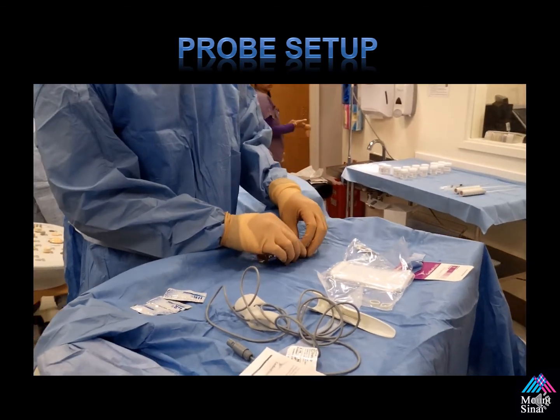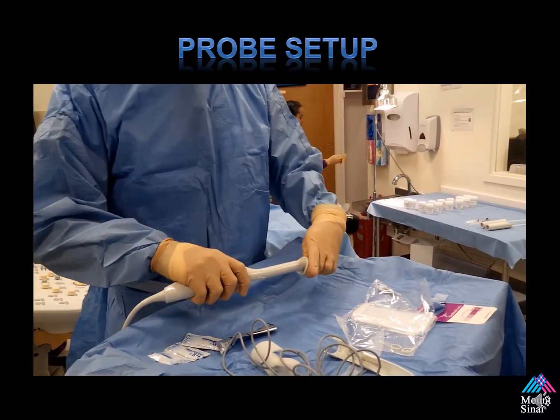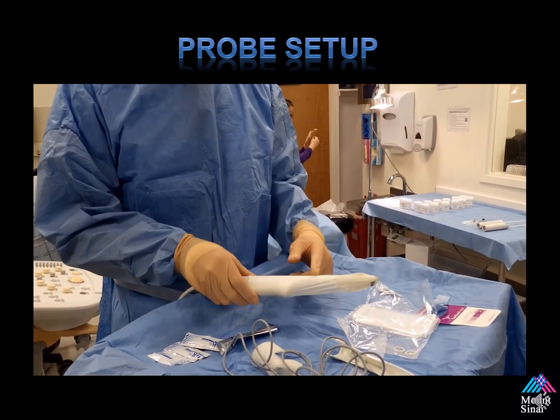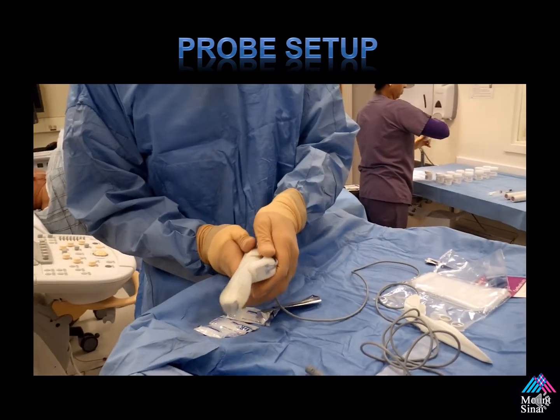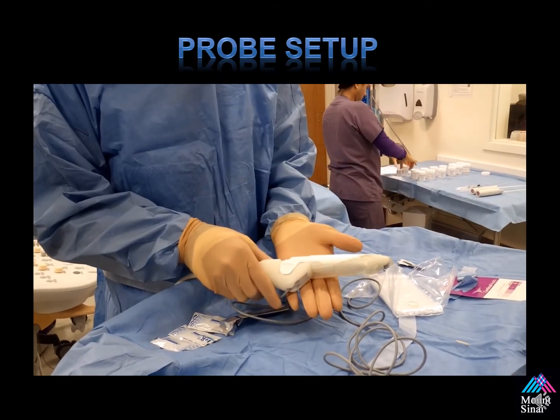We begin by using a non-lubricated latex condom. We use these instead of the Civco condoms because they're much thinner and they're able to lock the equipment over them. The tracker hub or clip must seat on perfectly — if this is loose, it can cause errors in your fusion. The Civco needle guide must also click on and be perfectly stable.